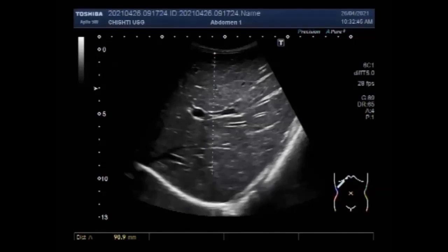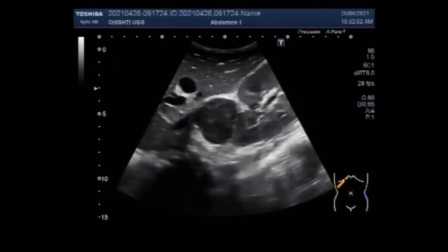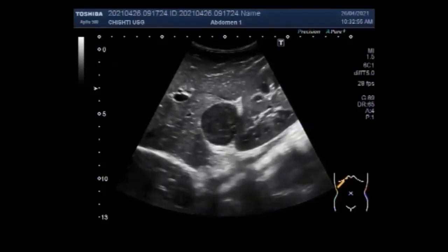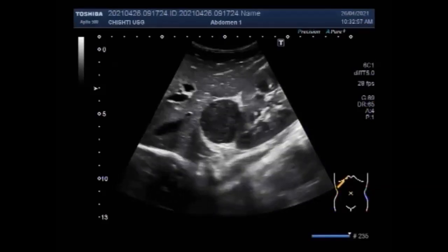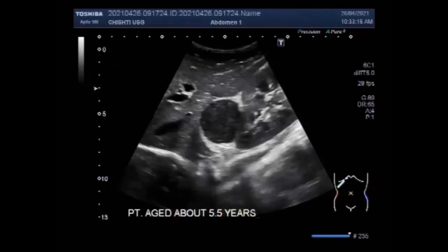You can see the liver. The posterior right sub-hepatic space, also known as the hepatorenal fossa or Morrison's pouch, separates the liver from the right kidney. The patient is a male child aged about five and a half years. You can see the liver, right kidney, and a mass in between the lower pole of the kidney and liver — that is, in Morrison's pouch.